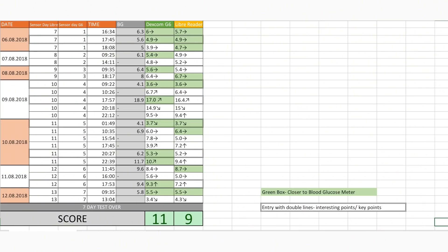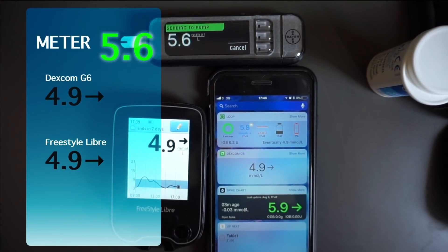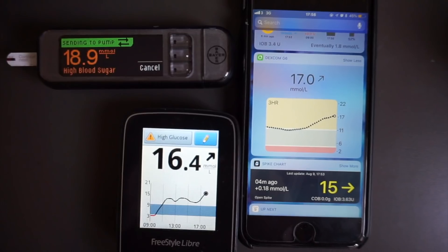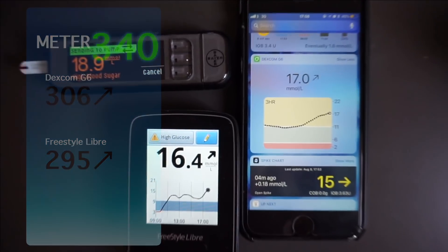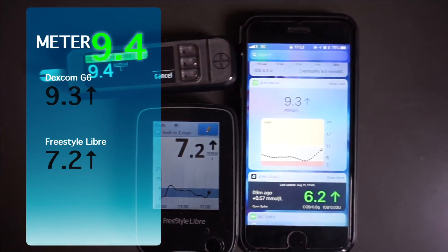Generally speaking, both are very accurate. I'm highly confident making treatment decisions from both. My Excel spreadsheet shows the Dexcom G6 to be more accurate, but we need context. When in range, Dexcom and Libre often showed the same number, which was reasonably accurate compared to finger pricks. Dexcom G6 is more accurate when high or above target, and I think it's more responsive to rapid glucose changes.